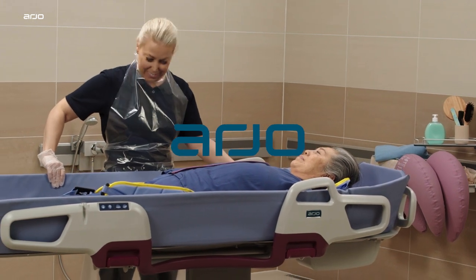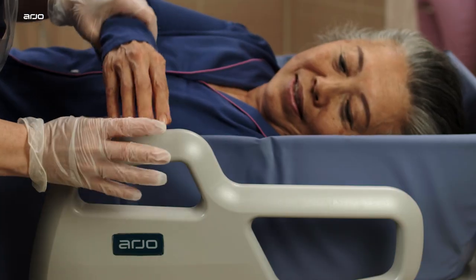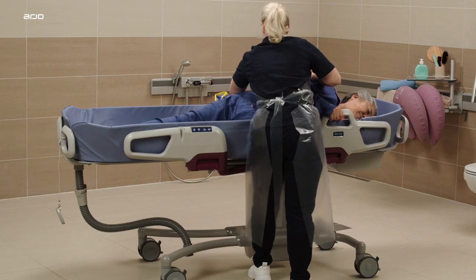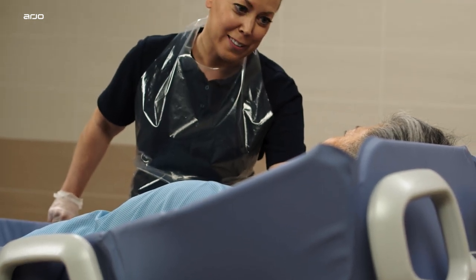The Corivo shower trolley is designed to provide a comfortable shower experience for patients and residents who need to remain in a lying position, while enabling the caregiver to work efficiently and ergonomically.